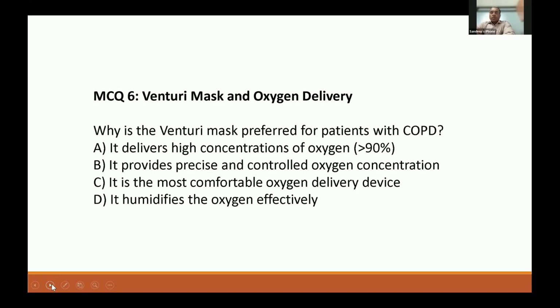You want to answer, Dr. Gunadhar? Yeah, I think we have just discussed this. So it's very important that you understand. Those who have answered C need to understand that it is not about the comfort. It is the most important way to control oxygen therapy in a patient of COPD, or where you don't want to give very high concentration of oxygen. There, the Venturi is a very important tool.